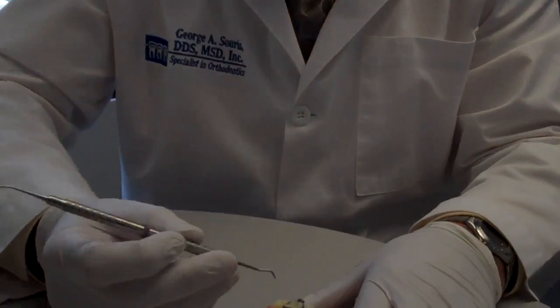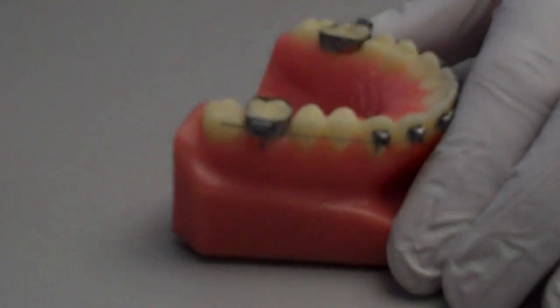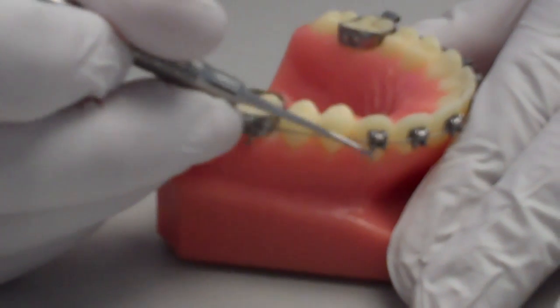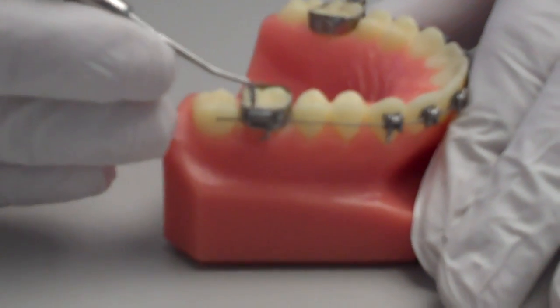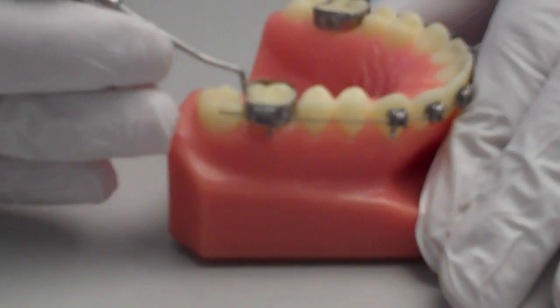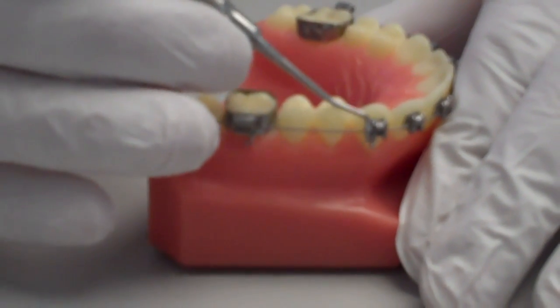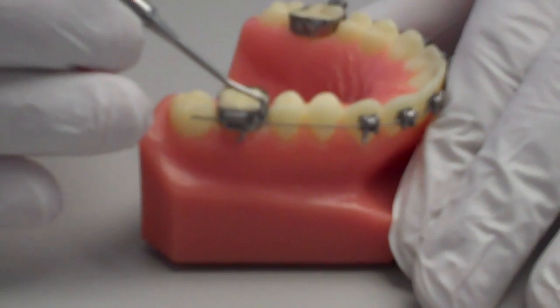Hello, I'd like to take a few moments to review the emergency care of loose and poking wires. Let's zoom in on our model here, and let's start by reviewing the parts of the braces. The little square attached directly to the front of the tooth is called a bracket. The little metal ring that goes around the tooth in the back is called a band. And the wire runs between those. And the wire is actually what allows the teeth to move.